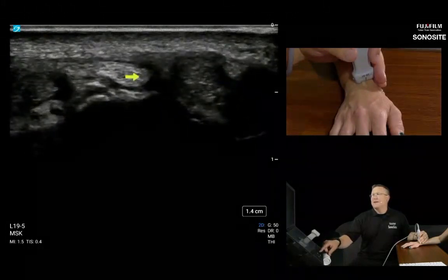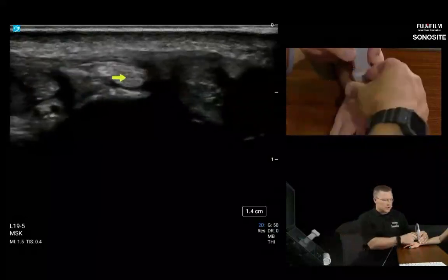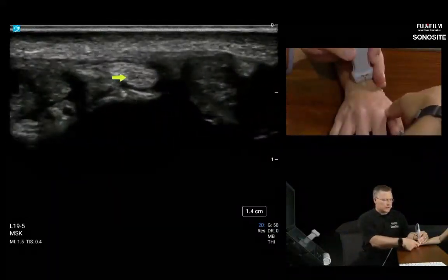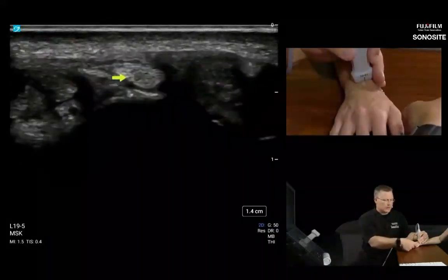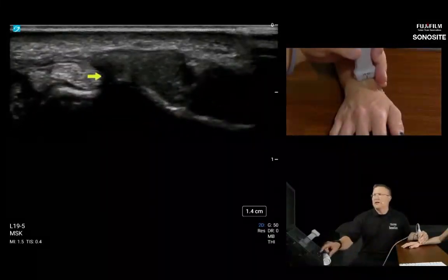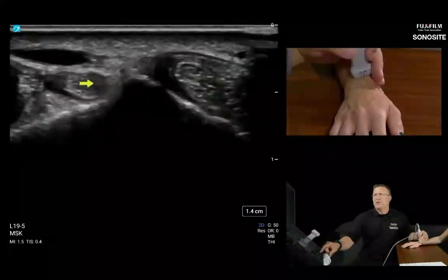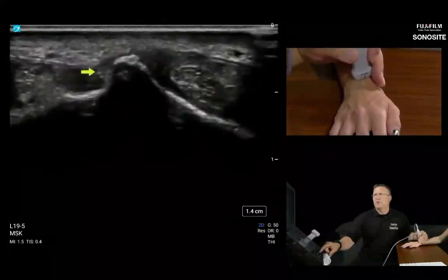I can't keep my transducer orientation at this point. What I have to do is turn the probe 90 degrees to the thumb. I need to go in line this way because that's the direction this tendon's going to go. When I'm scanning an EPL, sometimes it's just neat to have the patient wiggle their thumb first. So what we're going to do is just wiggle the thumb.